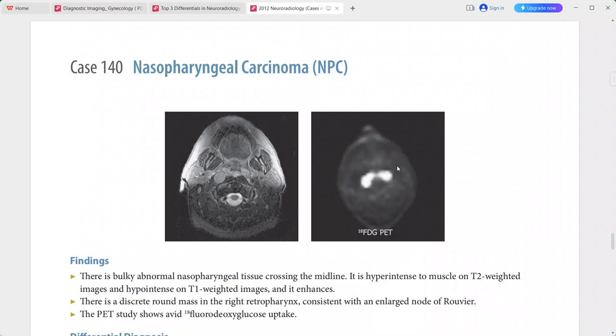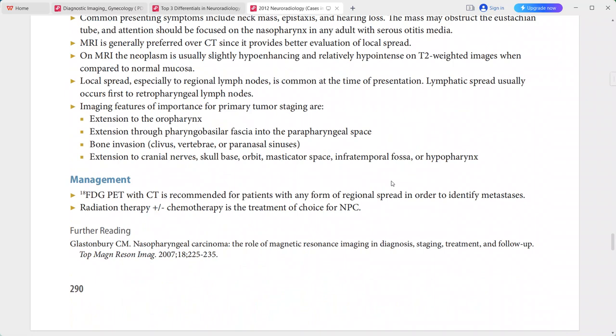A PET study shows avid FDG (fluorodeoxyglucose) uptake in the lesion. This is a typical case of nasopharyngeal carcinoma. Differentials include lymphoma and other skull-base malignancies that can produce a similar appearance.